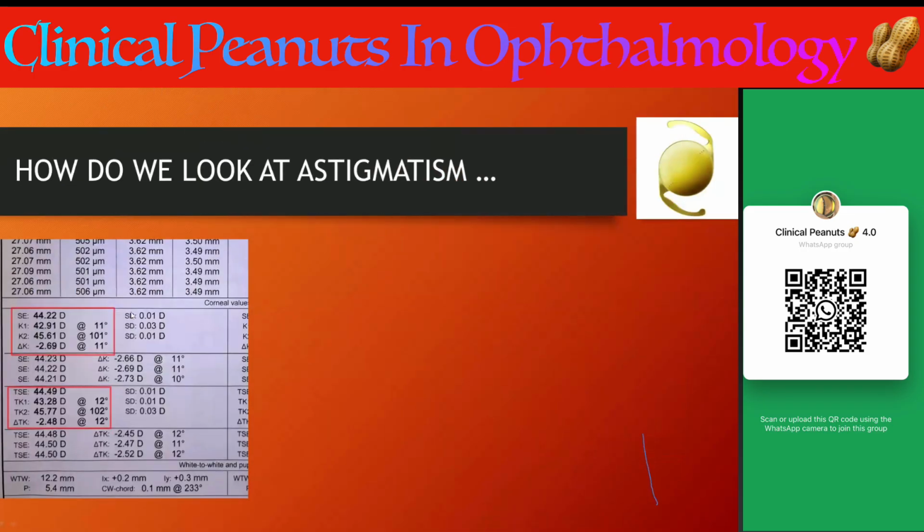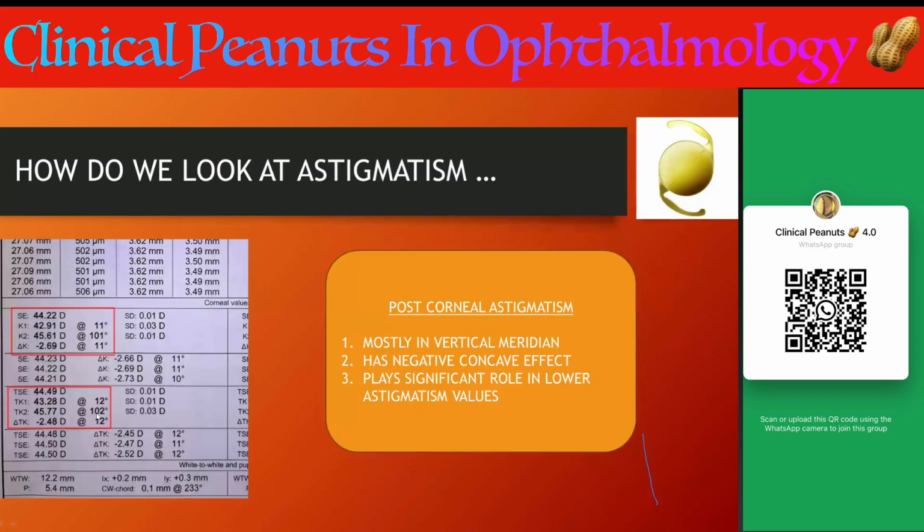This understanding and calculation is very important in toric IOL calculation. Similarly, this is the calculation from the IOL Master 700, where you can see the K value and the total corneal astigmatism with the adjustment for the posterior cornea. What is unique about the posterior cornea is that the astigmatism mostly lies in the vertical plane, has a negative or concave effect, and plays a significant role especially in lower astigmatic values. Whenever you are going to correct 1.5 diopter of astigmatism or less, the posterior corneal astigmatism plays a significant role.